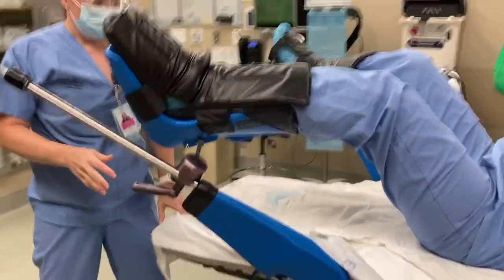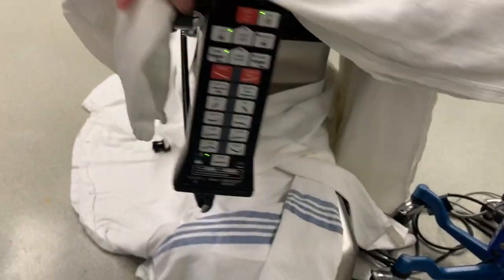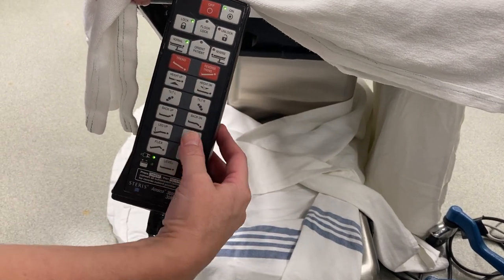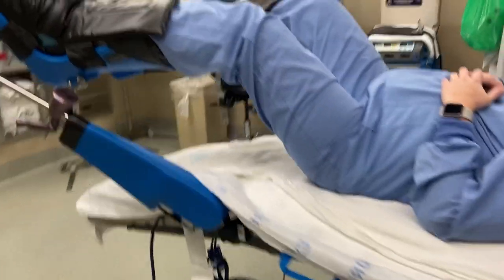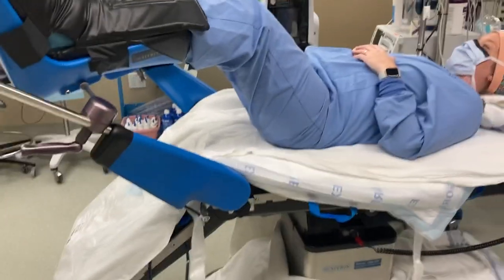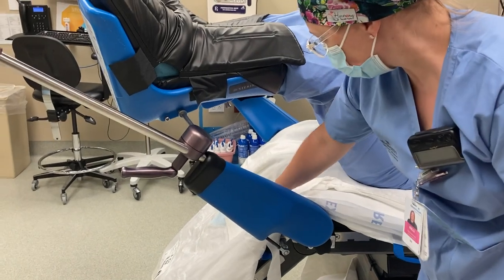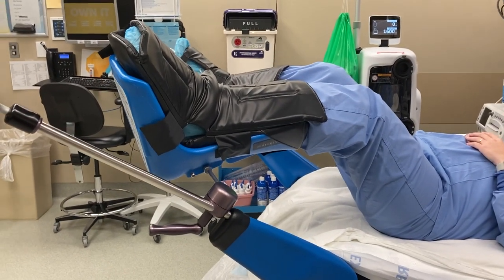And then at that point, when you have the legs up, you can lower the bottom of the bed. You can bring the patient down to where the bed goes down and then adjust the stirrups as the doctor needs. Thank you, Kelly and Allie.